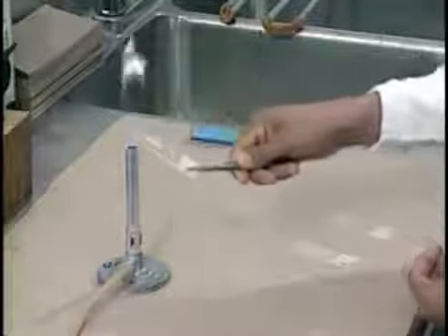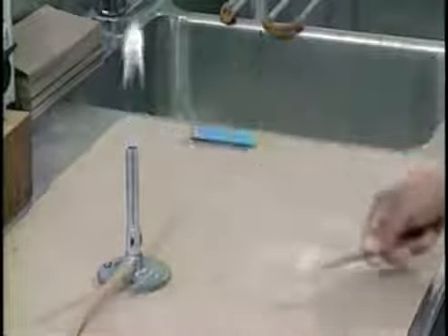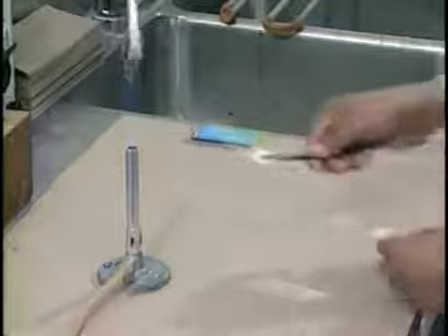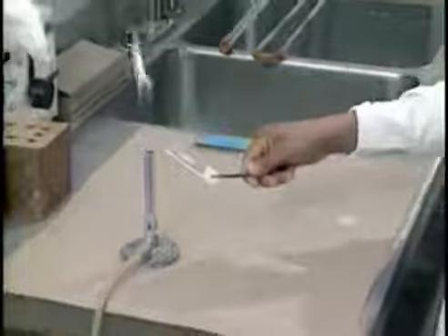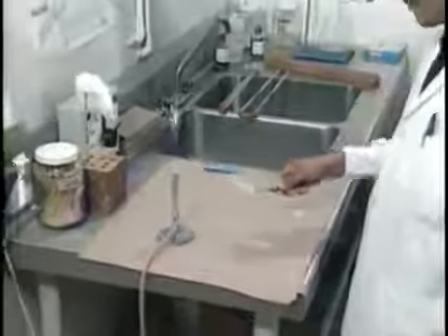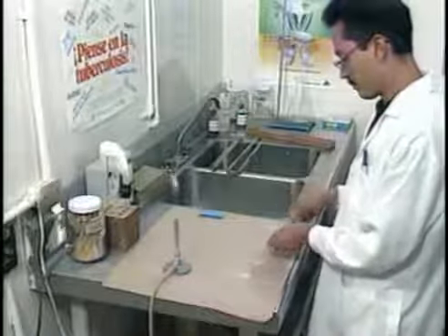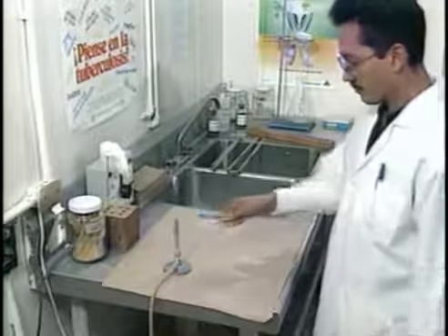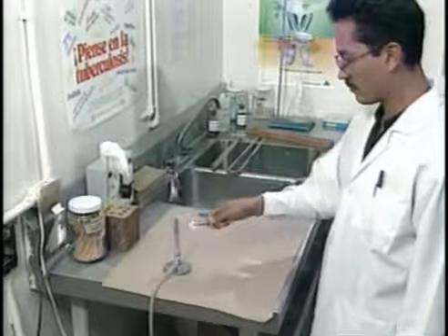When dried, fix the slides using the blue flame of a Bunsen burner. With forceps, pass the slide briefly through the flame 3 times, smear side up. Heat fixation ensures that the sputum will stick to the glass slide. Excessive heating could damage the bacilli. If not sufficiently heat fixed, the acid-fast bacilli may wash off during staining.